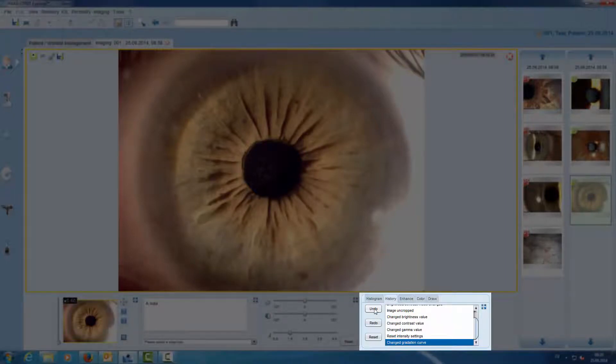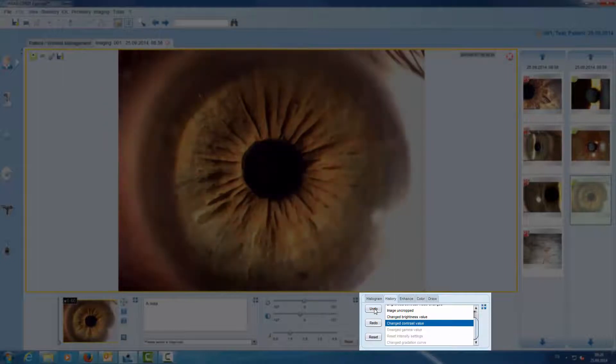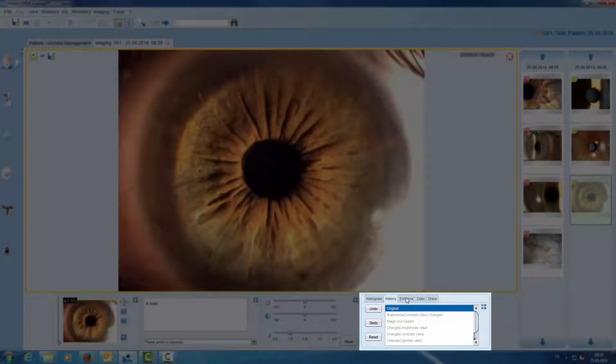In the history tool we can undo actions or with one click we go back to the original image.